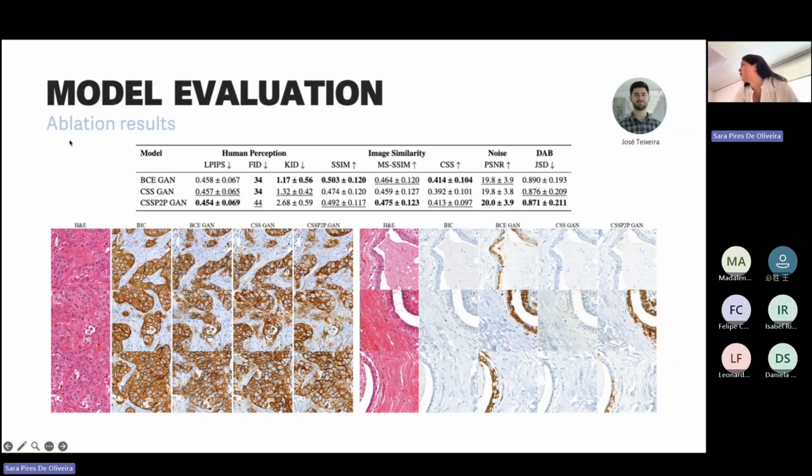This is very difficult for you to see here on such small images. But the thing is that because we are trying to account for the differences in structure, like luminance and contrast, it really highlights the difference when it comes to the brown, because it's the most different from the stain of the H&E.